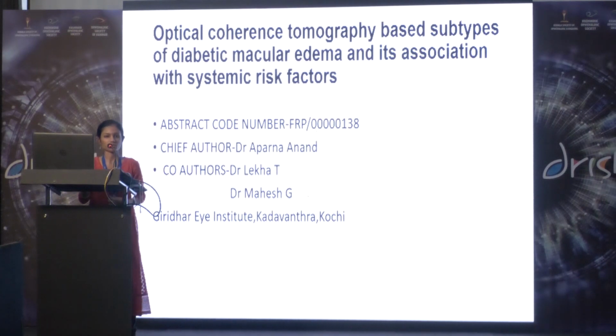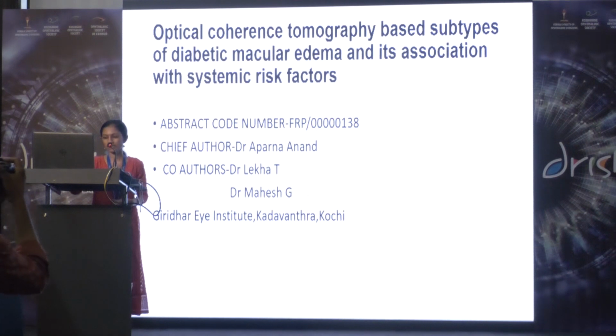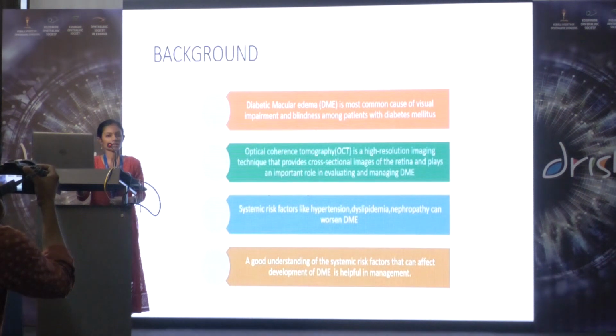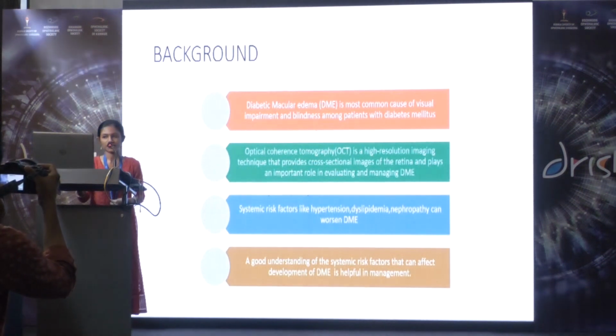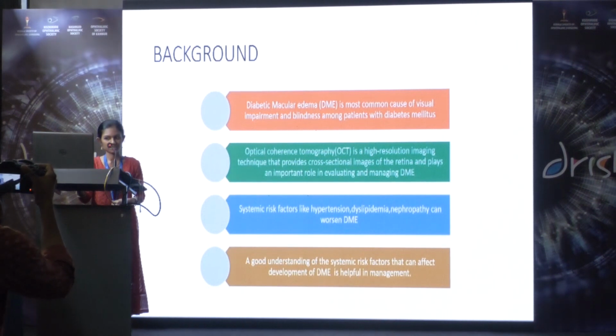Good afternoon. My topic for paper presentation is optical coherence tomography based subtypes of diabetic macular edema and its association with systemic risk factors. Moving on to the background, diabetic macular edema is the most common cause of visual impairment and blindness among patients with diabetes mellitus.